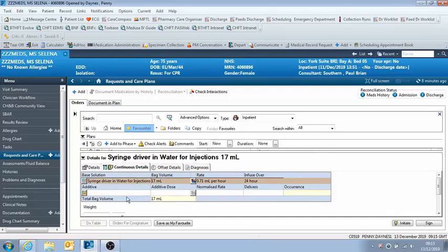Okay, so this is what the power plan looks like when you open it up. And then in order to add drugs to it, you need to click here on the additive box.